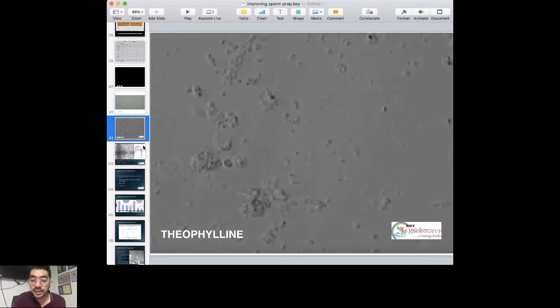Now, Tejal, basically you're talking about the hypoosmotic swelling test. The hypoosmotic swelling test is when you have a hypoosmotic solution. Water is a hypoosmotic solution, but I would not recommend using water for HOS. What you basically do is dilute the media with sterile water, and then subject the sperms to this solution. Because it's a hypoosmotic solution, water will enter the sperm if the membrane is intact, and it'll stay there, causing a swelling or coiling of the sperm tail. But if the membranes are not intact or the sperm is dead, water enters and goes out because the membrane loses its permeability, right?